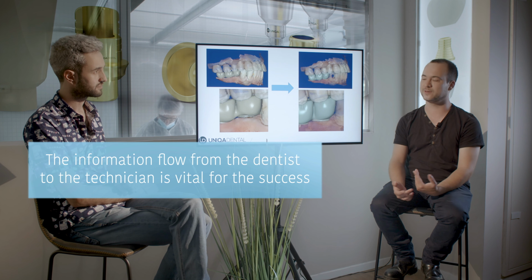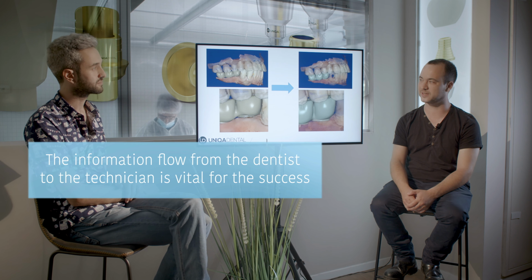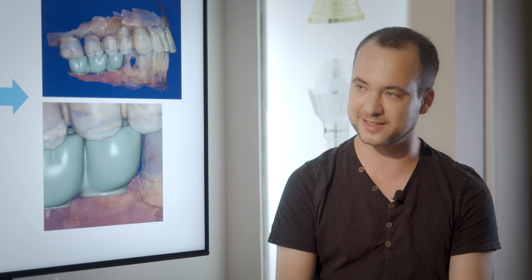Yeah. The more things you want to do, the more information needs to go between the doctor and the technician. But in this case, you save at least one appointment and a lot of work for the technician. Because you use CAD CAM, because you use an intraoral scanner, it's impossible to do with the traditional methods. Impossible to be done? Impossible. Because you have a working model. On the working model, you can't change the analog's height. It's inside the model. Everybody's happy: the doctor is happy, the technician is happy, and the patient is happy.